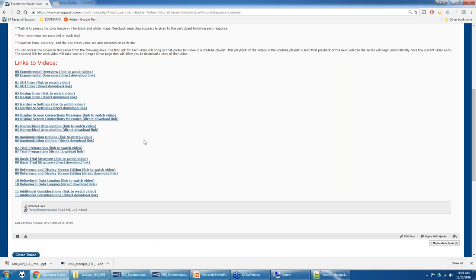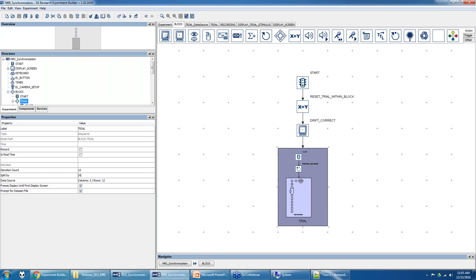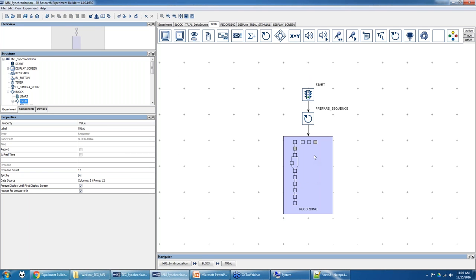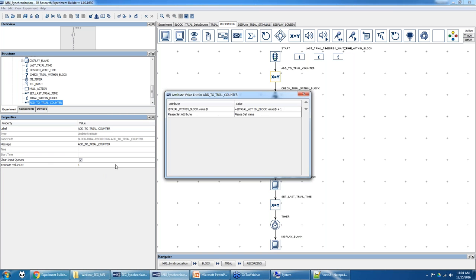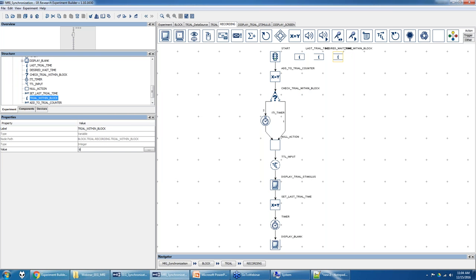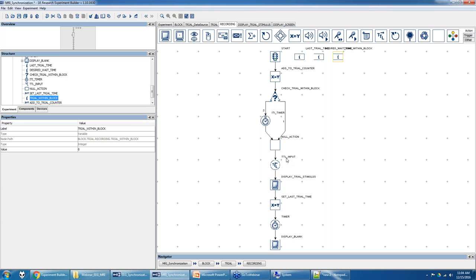On the first trial of each block, we want to start waiting for a pulse from the scanner rather than waiting a set amount. In this example, I'm using a TTL Input Trigger — different from the TTL action used in the EEG example. This is a trigger with a circular shape and an arrow pointing left, meaning we're waiting for TTL to come from the scanner. If your scanner sends the signal as a keyboard press, you would replace this with a keyboard trigger.